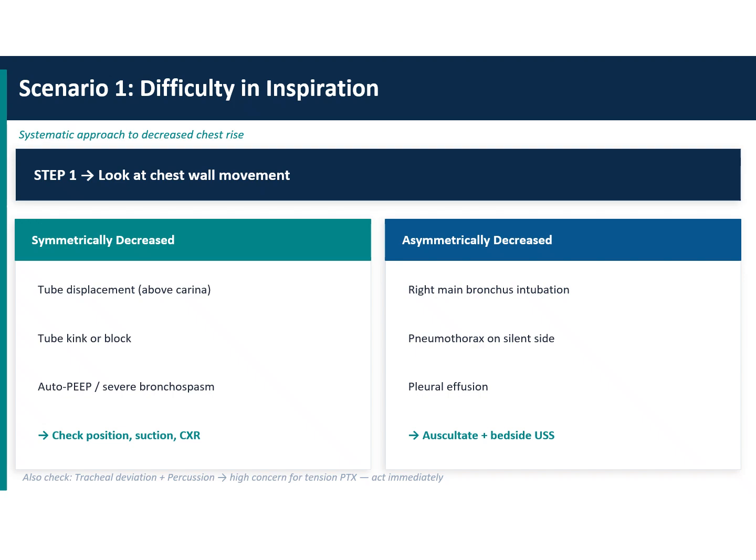So you have to probably look into JVP or some other parameters to understand whether there is pulmonary edema or not. If it is ARDS, then you have to assess whether the lung is more recruitable, whether you have to increase the PEEP, or whether the lung is already overdistended, whether you have to decrease the PEEP. That is what you have to understand.